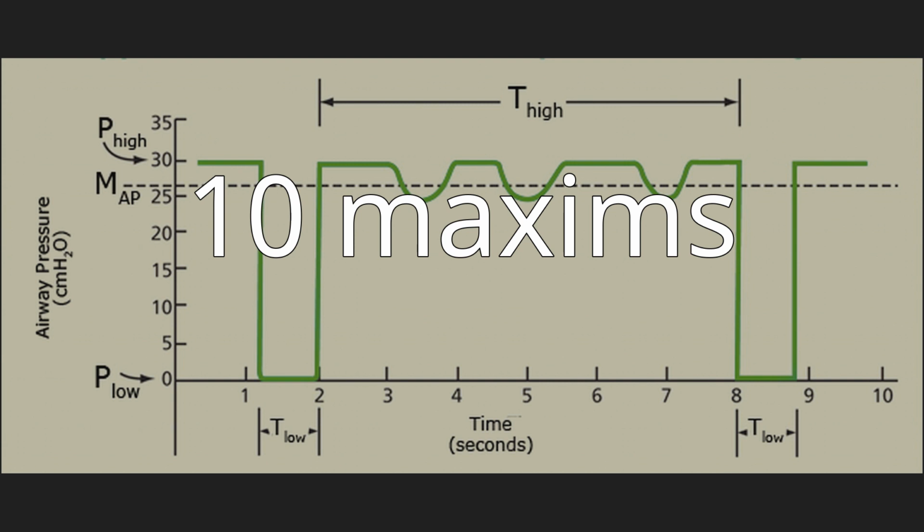Adaptive, a targeting scheme that allows the ventilator to automatically set one target, for example. Optimal, a targeting scheme that automatically adjusts the targets of the ventilatory pattern to either minimize or maximize some overall performance characteristic, for example, minimize the work rate done by the ventilatory pattern. Intelligent, a targeting scheme that uses artificial intelligence programs such as fuzzy logic, rule-based expert systems, and artificial neural networks.